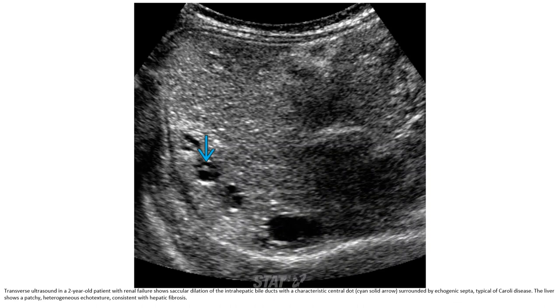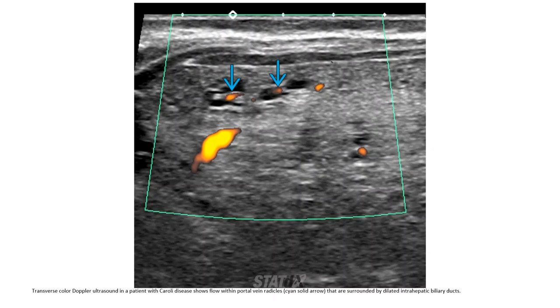Ultrasound in a two-year-old patient with renal failure shows circular dilatation of the intrahepatic bile ducts with a characteristic central dot, surrounded by an echogenic periportal region typical of Caroli disease in the liver, with patchy heterogeneous echotexture consistent with hepatic fibrosis. Ultrasound in another patient with Caroli disease shows flow within portal radicals, surrounded by dilated intrahepatic biliary ducts.